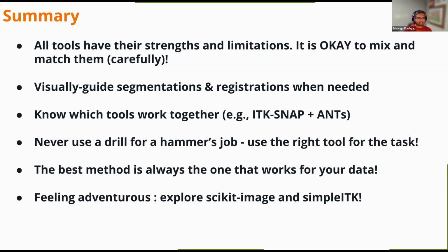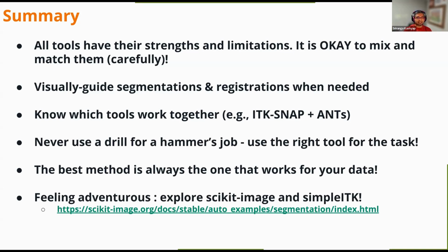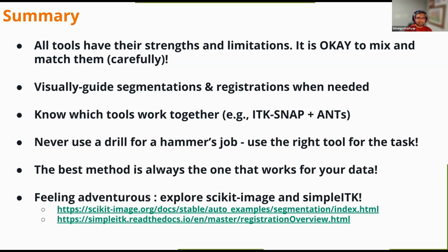If you're feeling adventurous, I would strongly suggest looking at these examples in the scikit-image and the registration pages of SimpleITK.